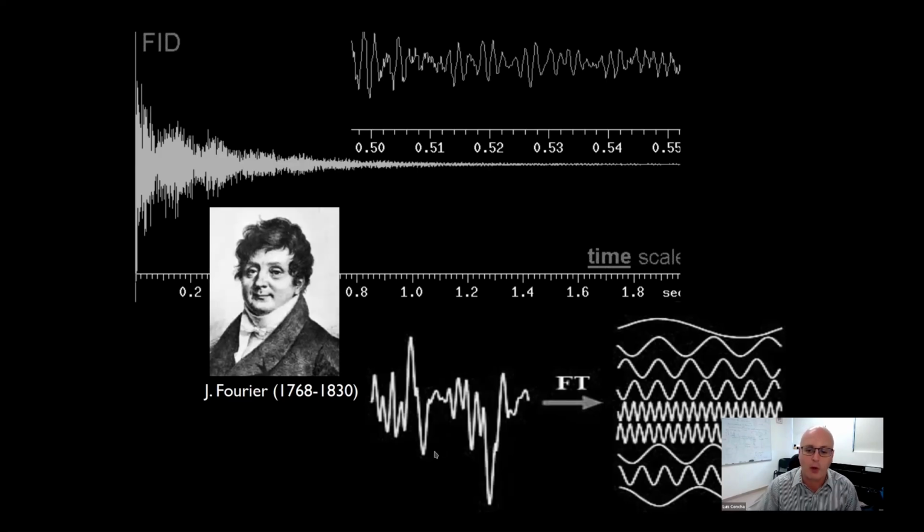So this is like a chord on the piano, right? You can play C, G, and E at the same time. It will sound like a chord, but the Fourier transform says that this is just 3 keys that are pressed in unison. And not only that, the Fourier transform can tell us that we actually pressed the key of C a little bit harder than we pressed the other 2 keys.